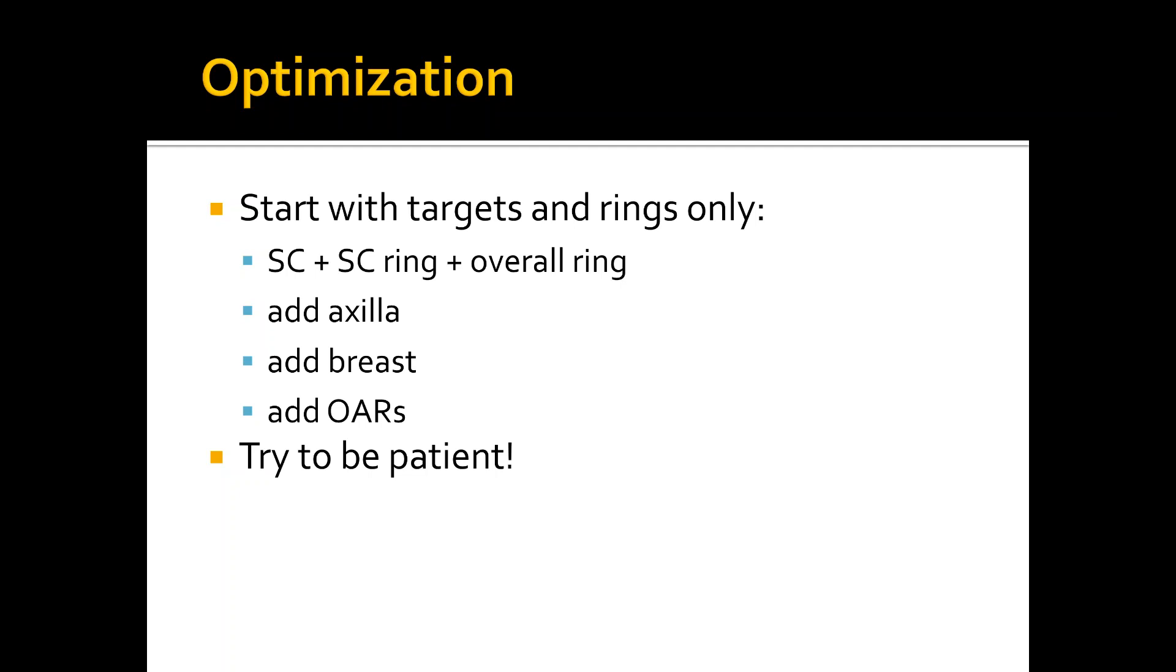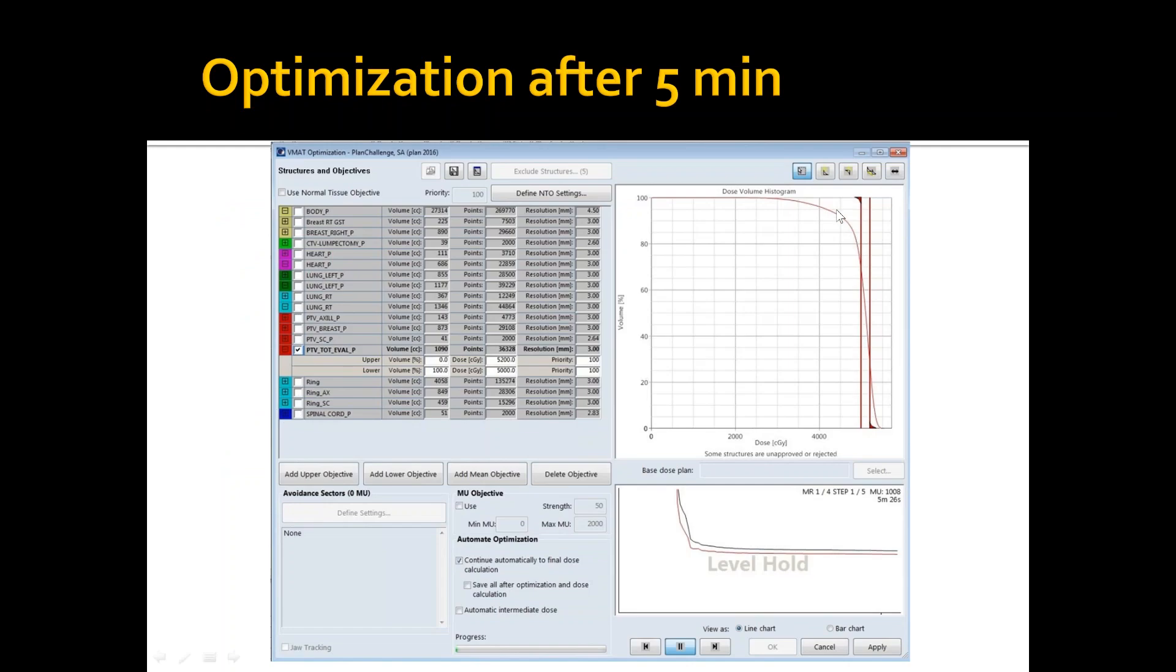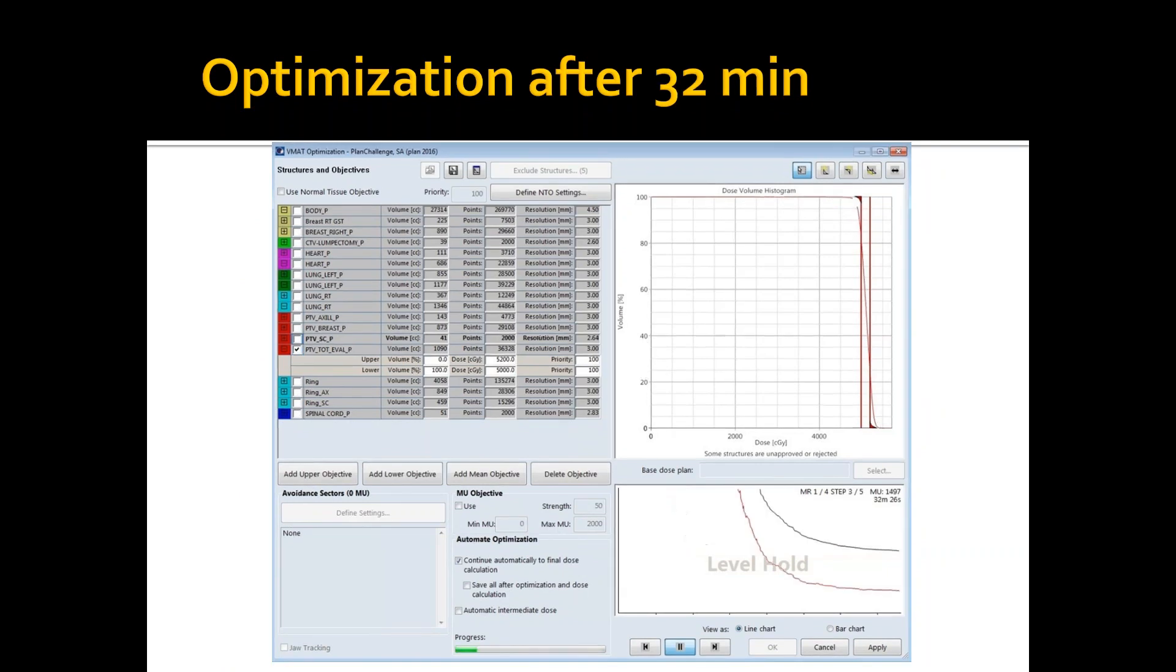This is my optimization after five minutes. As we can see here, it did not achieve the target very well, although the system has plateaued. So when I totally try to be patient, as we can see in this example, after 32 minutes only, and that's step three out of five, and we're still at phase one out of four, we can see that the DVH started to find - the system started to find good solutions for the total target.